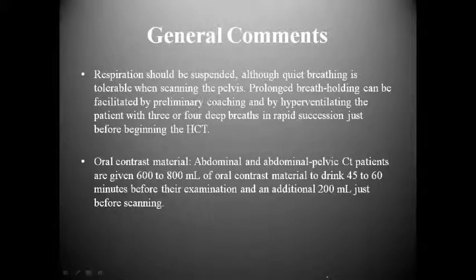So general comments: respiration should be suspended anytime that you're doing an abdomen pelvis. However, we know that not everybody can suspend their respiration, and so quiet breathing is tolerable when scanning the pelvis only.